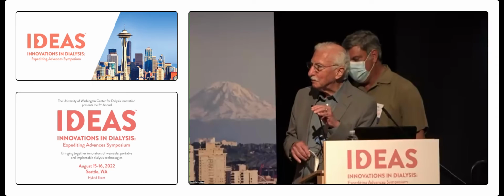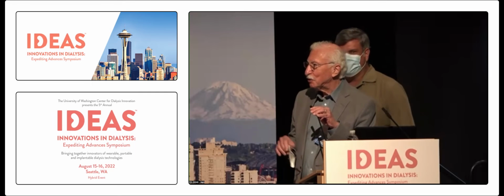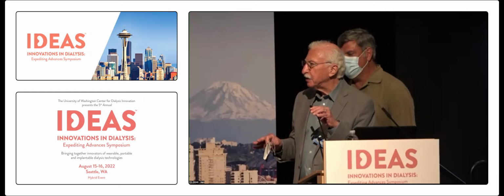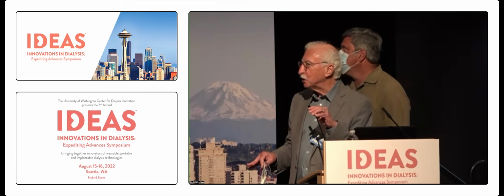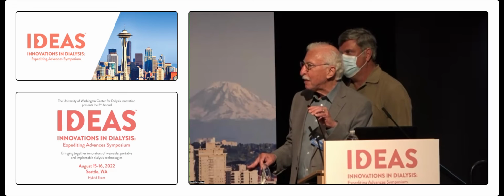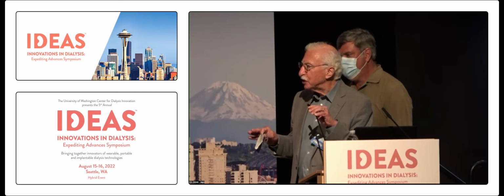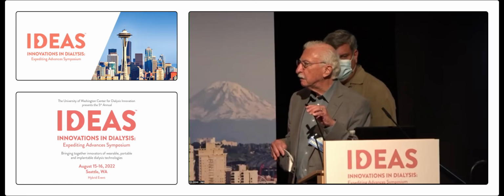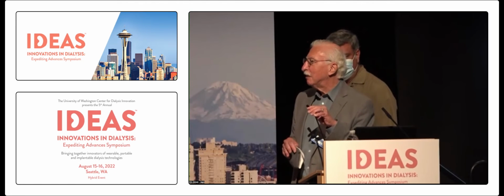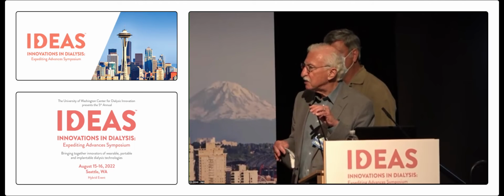Yeah, those are excellent questions. I teach a course on how to commercialize biomedical technology, so I am acutely aware of those questions. We do ISO 10993 testing in our own lab on all these coatings, and all of them have passed ISO 10993. But for the FDA, you have to do it under GLP, good laboratory practices, and that quadruples the cost for doing such experiments. I think we have some pretty good chemistries at the moment. I think they're readily scalable up, and I think just some partnership with commercial entities is going to allow us to get to the next step, to bring these to not just dialysis, but many other devices contacting the bloodstream.